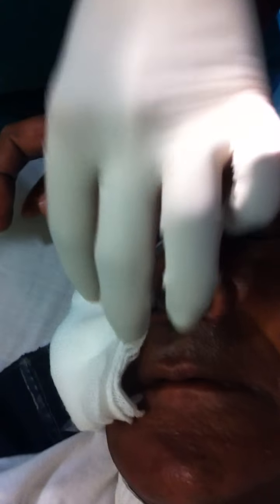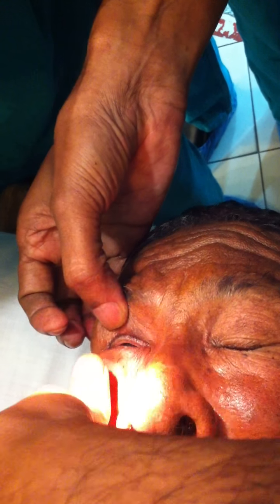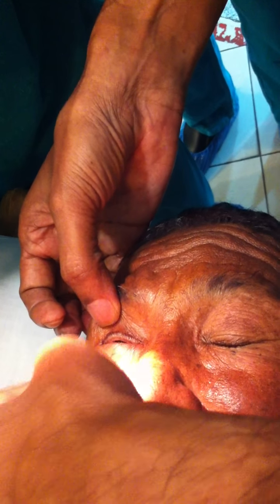Take out the needle. You feel the bony orbit? Now the second injection. The globe — see, this has filled up now, can you see? The globe has moved up. So here you have to be careful — the globe is very near to you.